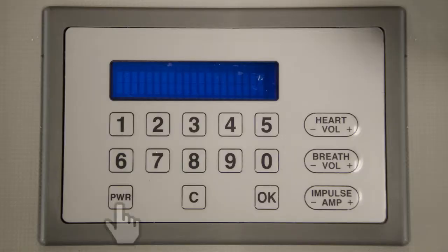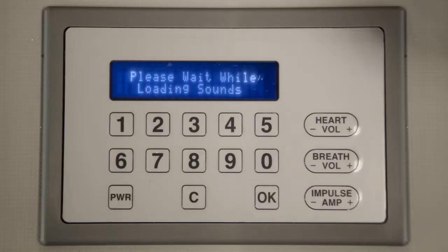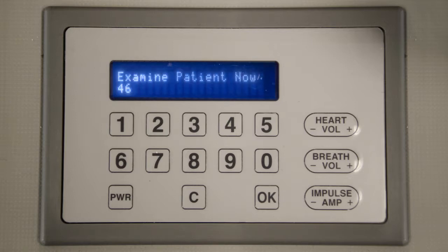Turn Harvey on by pressing the PWR button. You should see: please wait while loading sounds. After the unit initializes, you should see the message: examine patient now, disease code 46, normal.